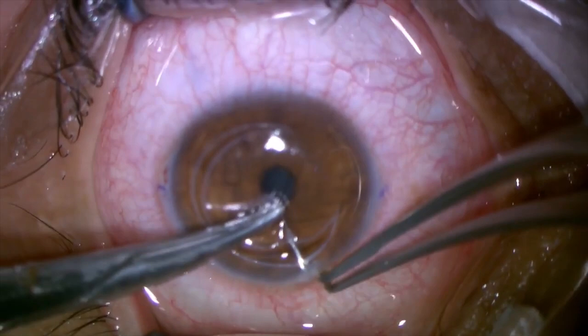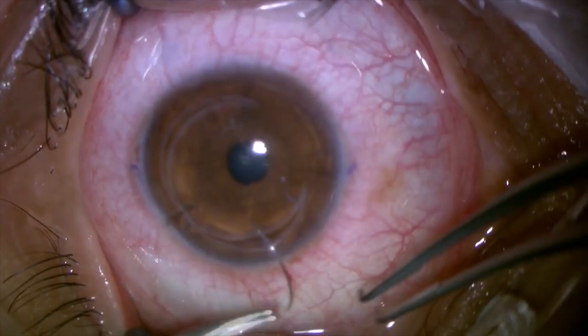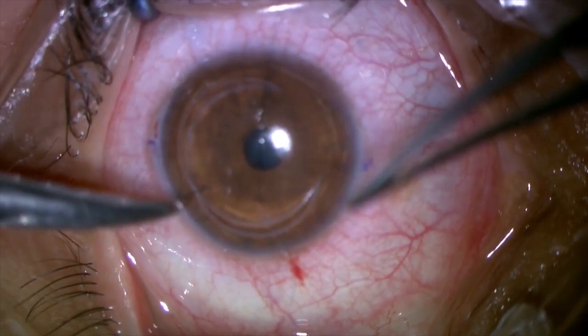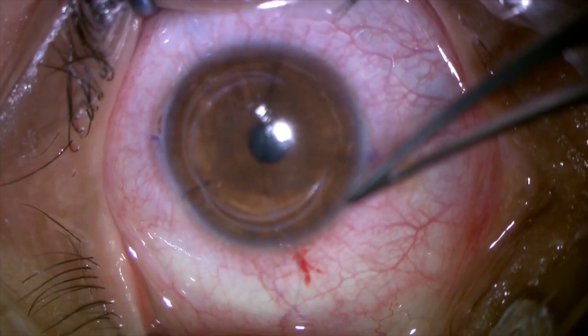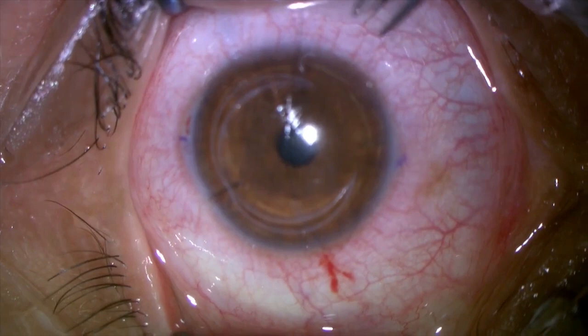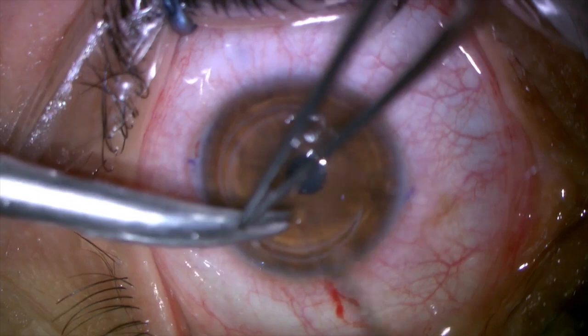So now we're going to start distributing the sutures evenly to distribute the forces and achieve a perfect apposition of the edges. As I said, we don't want them overlapping. We want to go 90% of depth. So the cornea, the edges fit perfectly. It's very important to say that for each keratoconus, the geometrical figure is different. The axes are different, in order to remold the cornea in both meridians, because each keratoconus is different.